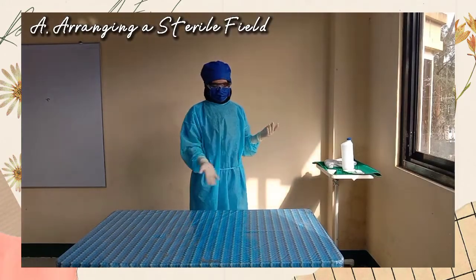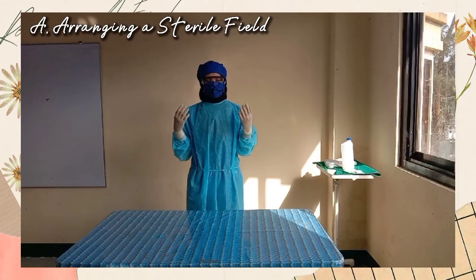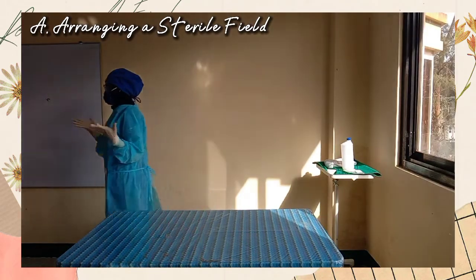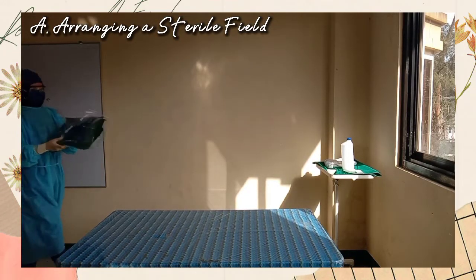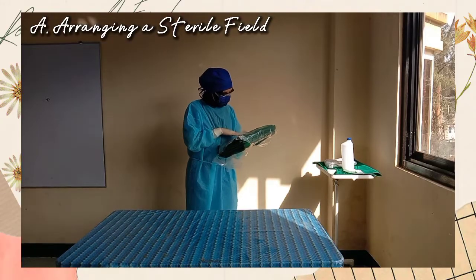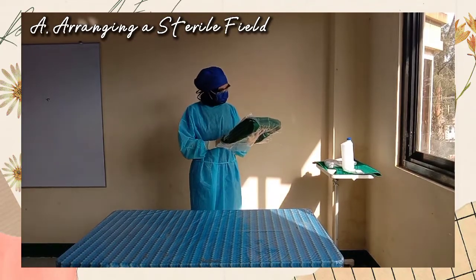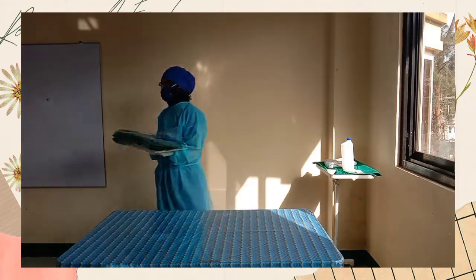Choose a flat, hard, dry surface and clear sufficient area on which to prepare a sterile field, to have plenty of room to work. Before sterilization, objects are wrapped, and the wrapper, when opened, provides a sterile field to allow opening without contaminating the contents. Determine the sterility of the package: ensure that the package is dry, check the expiration dates, and look for indications that it has been previously opened. Any package that is contaminated must be discarded.